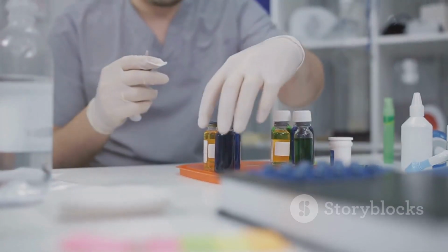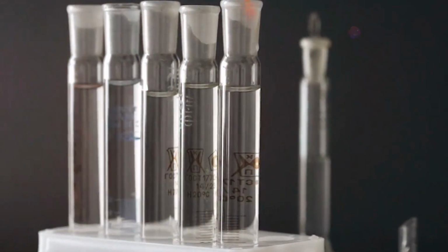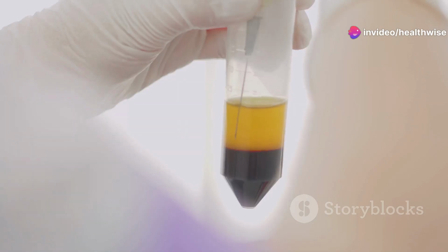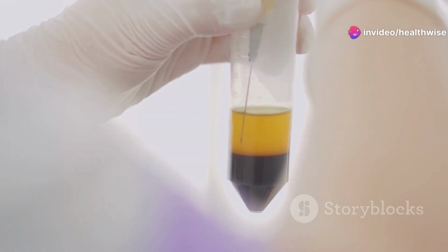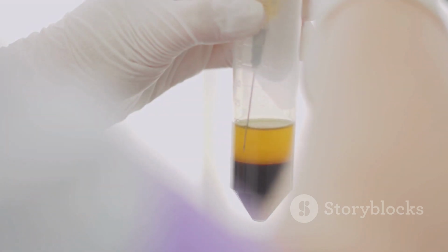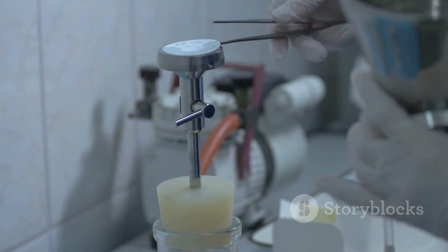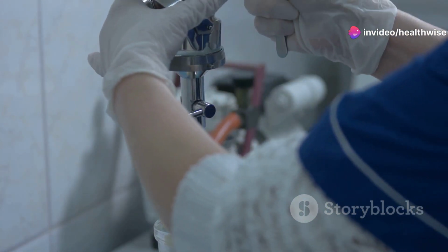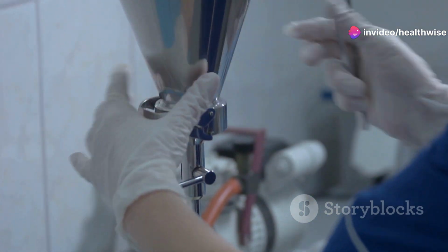Now for the working standards. You'll dilute the stock standard according to table 5.3. Here's a quick summary. Tube 1, 0 mg/dl glucose, 1.0 milliliters isotonic sodium chloride solution. Tube 2, 90 mg/dl glucose, 0.25 milliliters stock standard, 0.75 milliliters isotonic sodium chloride solution.